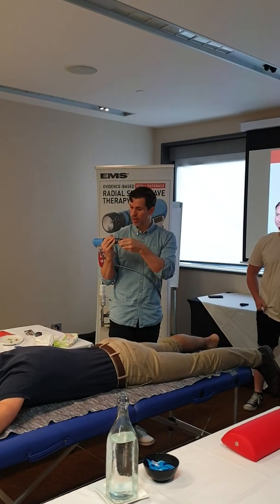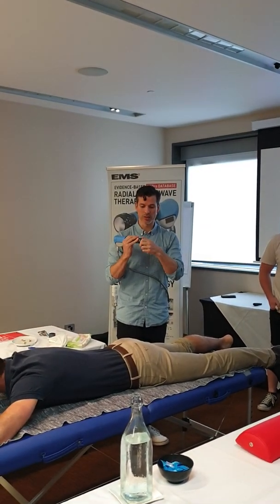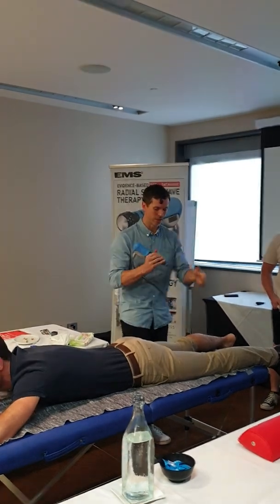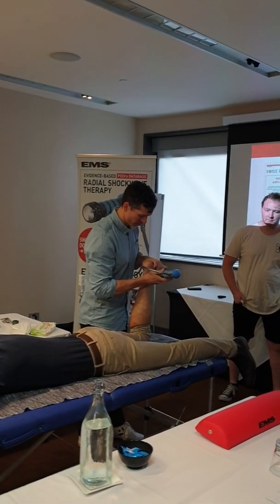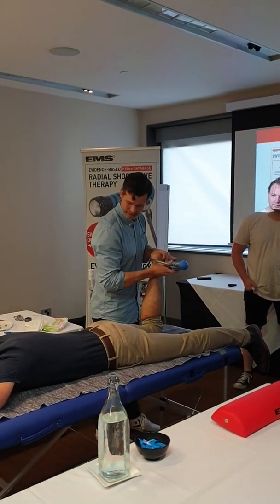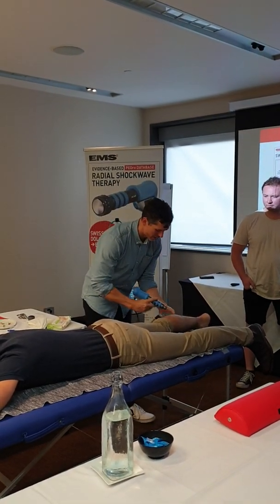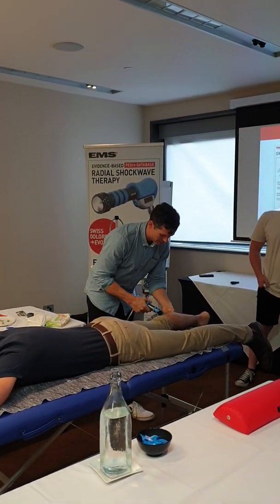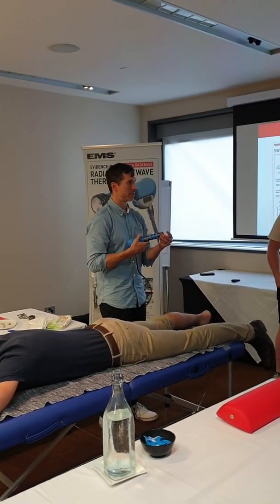Make sure this is on tight. Okay, if that's a little bit loose, you'll hear it. It'll sound different. It won't connect all the way through because it's sitting up too high. Does that feel different? Okay, so make sure that's on tight. Not crazy tight, but not loose.